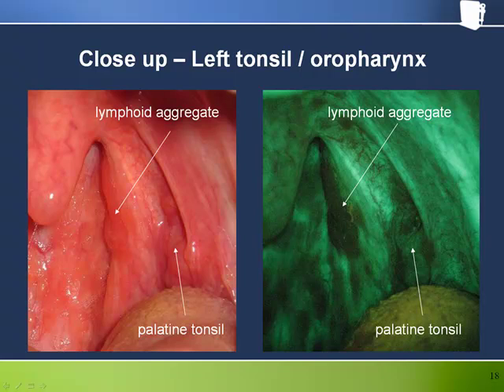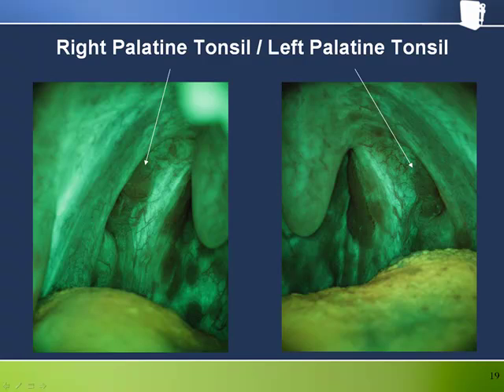This is the same patient with a good view both in white light and with fluorescence of the palatine tonsil and oropharynx. The somewhat alarmingly dark area on the rear pharyngeal fold is just another lymphoid aggregate and is also quite evident under white light. Here are some particularly nice photographs showing the right and left side of the back of the throat, giving you a sense of the power of fluorescence in helping you visualize some of the rich structure present in the oral cavity.